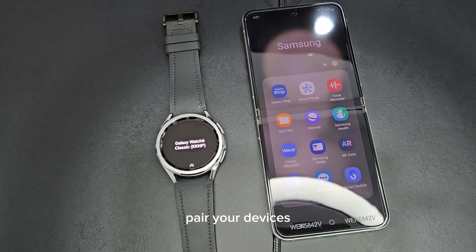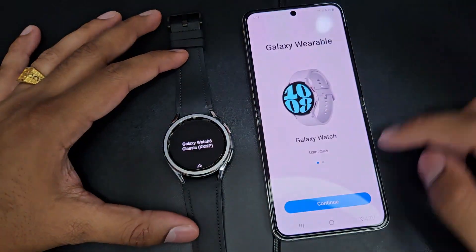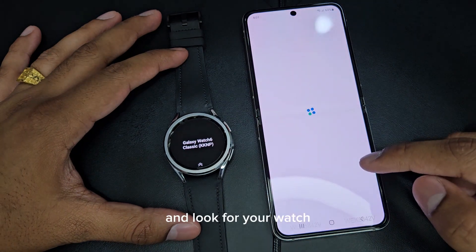So first step, pair our devices. Go to Galaxy Wearable and look for your watch.